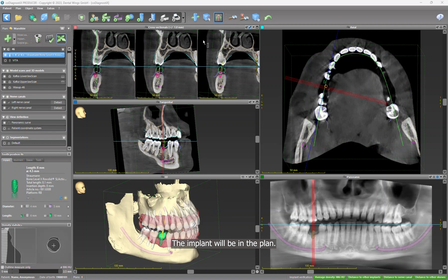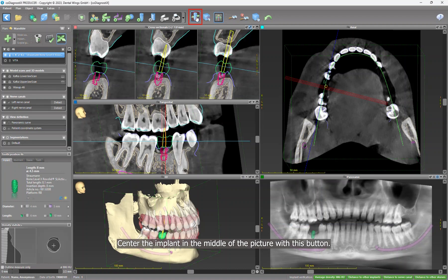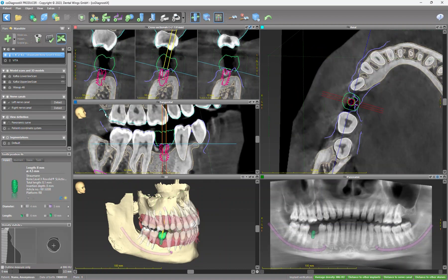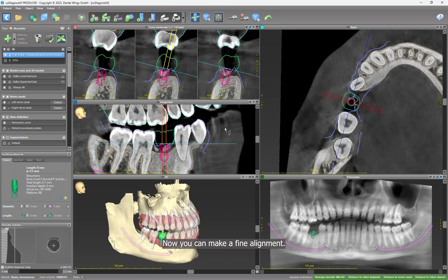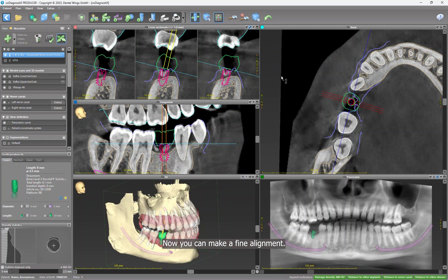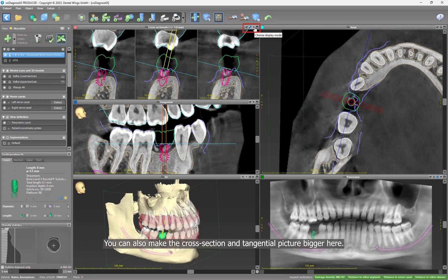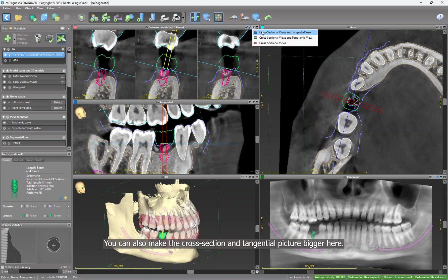The implant will be in the plan. Center the implant in the middle of the picture with this button. Now you can make a fine alignment. You can also make bigger the cross-section and tangential picture here.